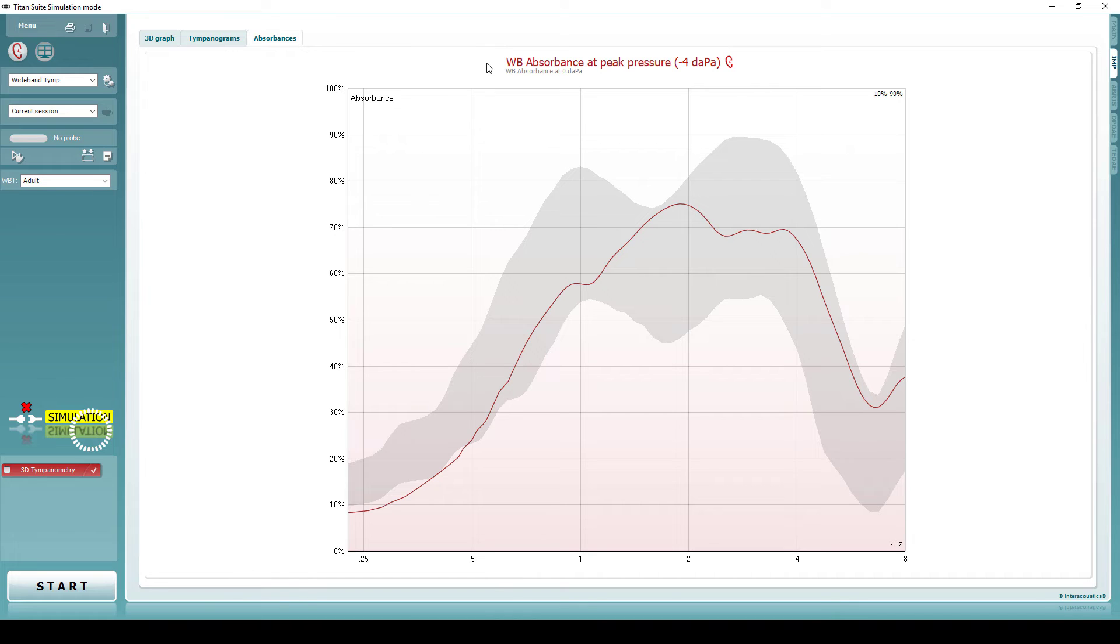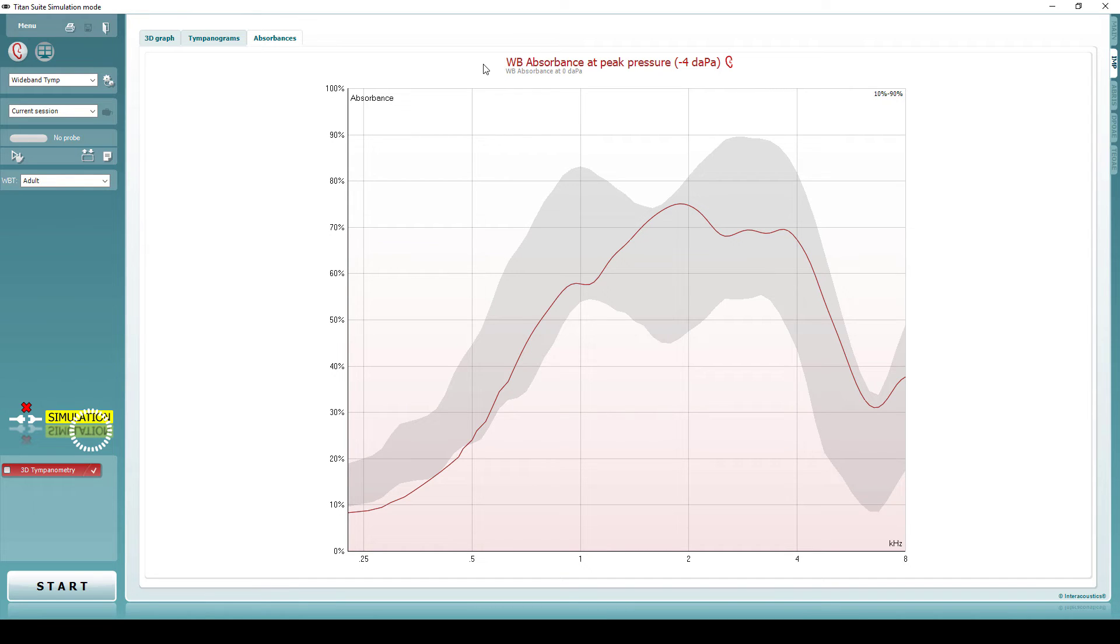The absorbance graph introduces a new measure found in wideband tympanometry. Absorbance is a measure of how much energy is absorbed by the middle ear. Different absorbance patterns can be indicative of different pathologies, and using the absorbance graph can add much more power to your interpretation than the standard type A, B, C classification.